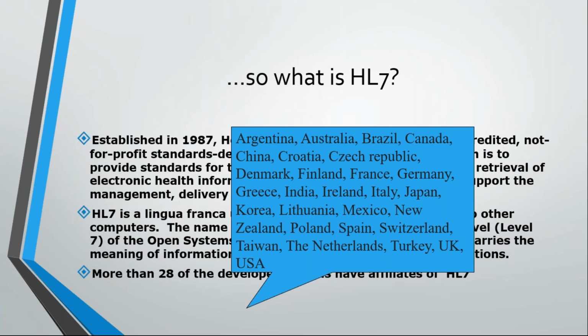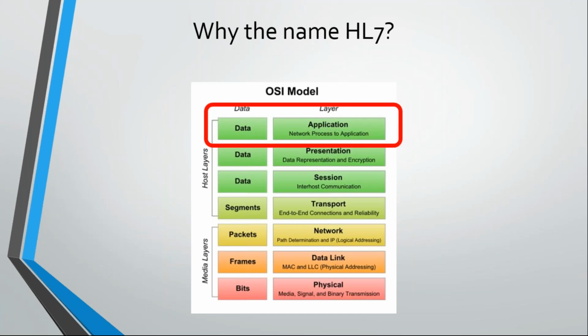We see that in Argentina, Greece, Australia, Finland, USA, UK, India, South Africa, and most of the UAE countries are also using HL7 today. So we'll quickly see how the name has been arrived.